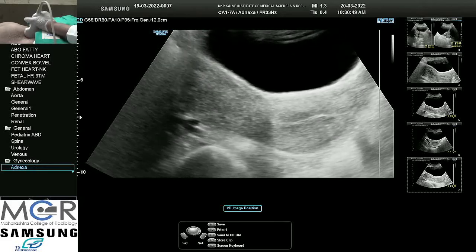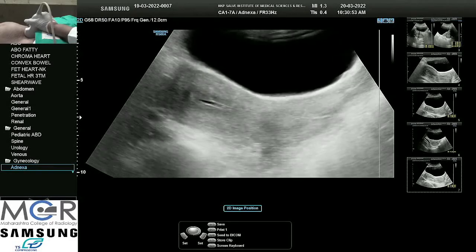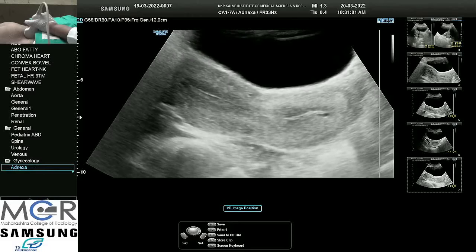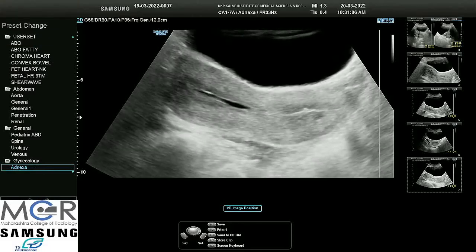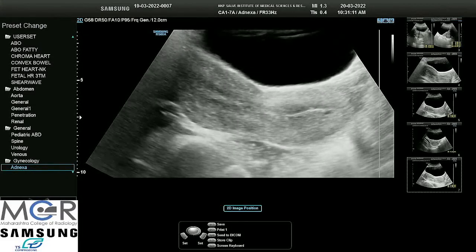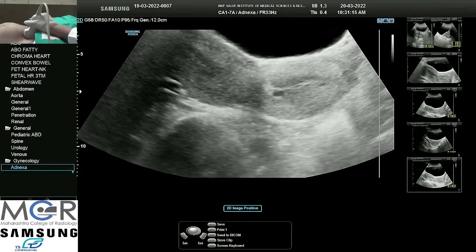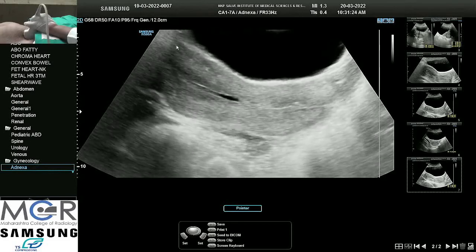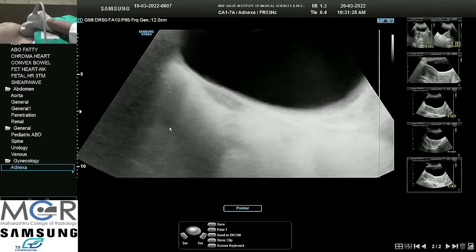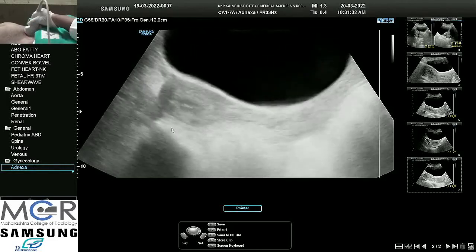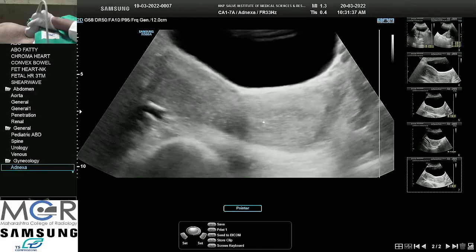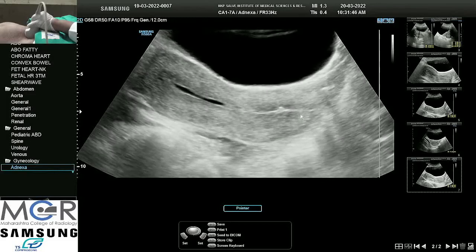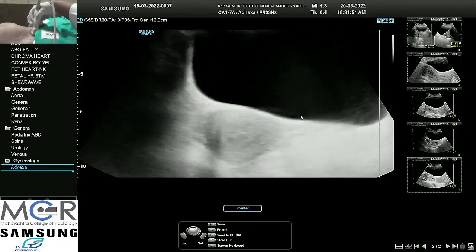We will ask the patient to void urine and come back. One important point: we should be very sure whether the uterus is anteverted or retroverted. If the fundus is towards the bladder, it is anteverted; if the fundus falls down, we call it a retroverted uterus. We should also note the angle the cervix makes with the uterus, to know whether it is anteflexed or retroflexed — this helps understand various problems, as a retroverted uterus may cause pain.